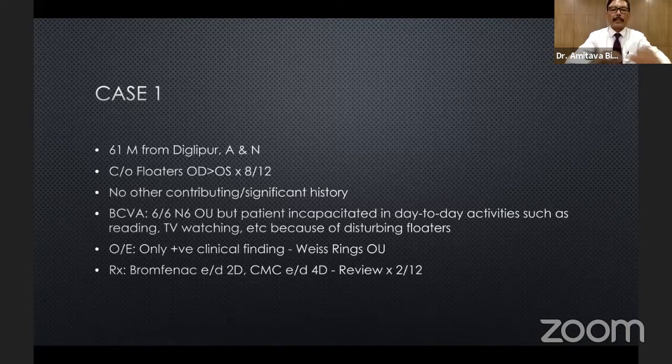So this is one of my initial days' lasers, of a 61-year-old male who had floaters in both eyes, and he was having difficulty in reading, TV watching and all that. I told him the option of the laser, and he said he wants to take a couple of months' time to decide. And where's the next slide?